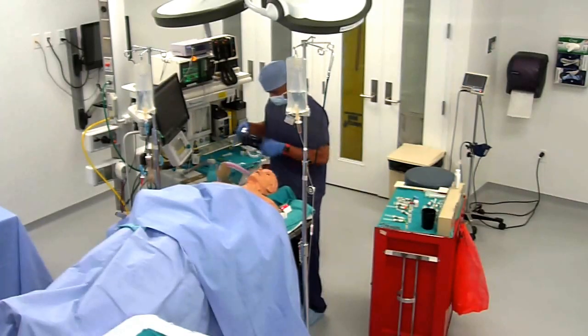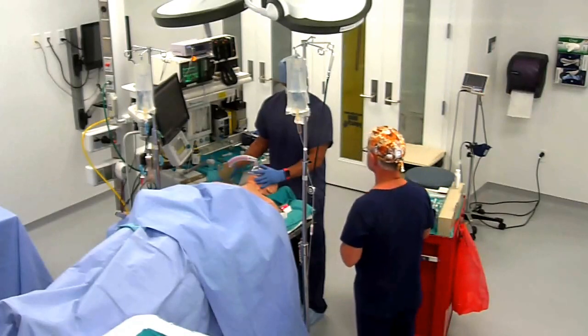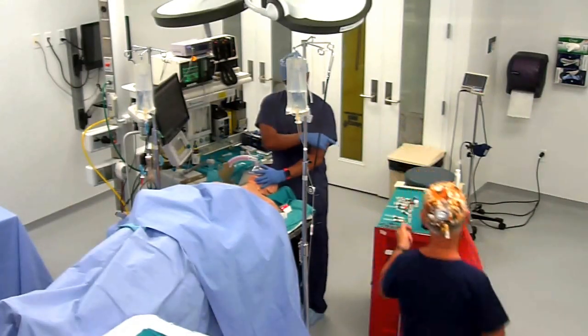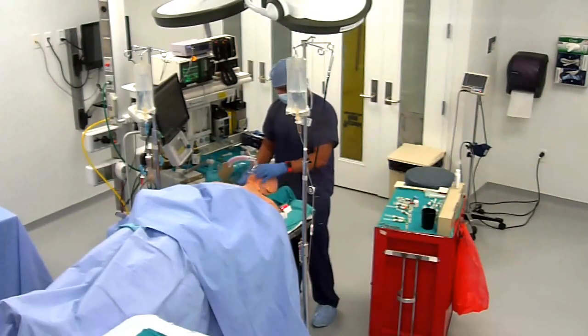Okay. And what do you want to do before you intubate? Did you already use muscle relaxant? Yeah, I gave it when I was given. Oh, well, it never registered, so you want me to... Okay, so you're okay. I put it in. Okay, good.